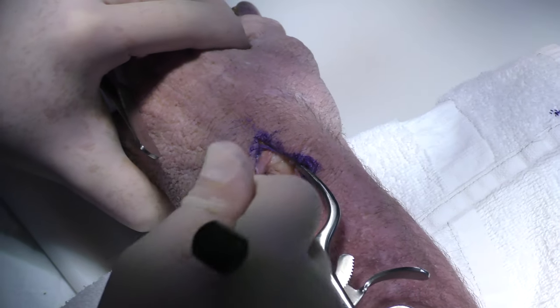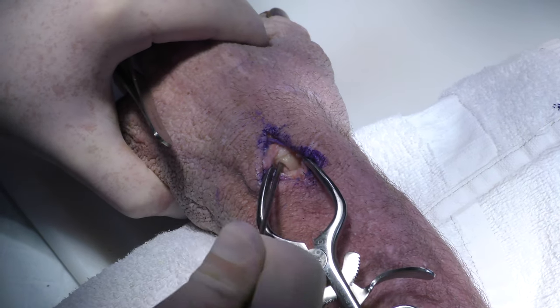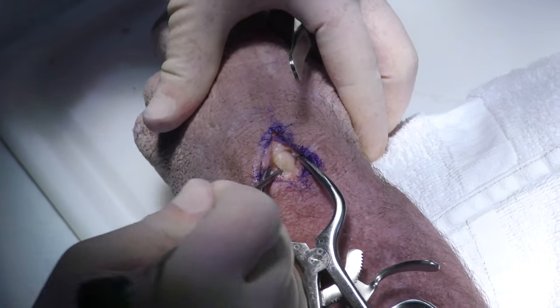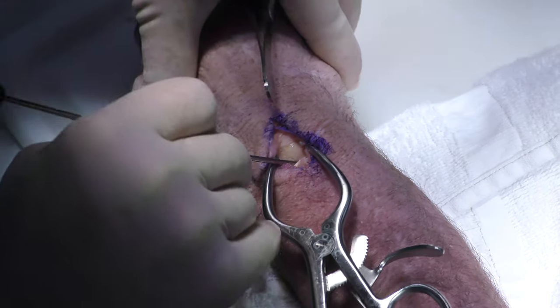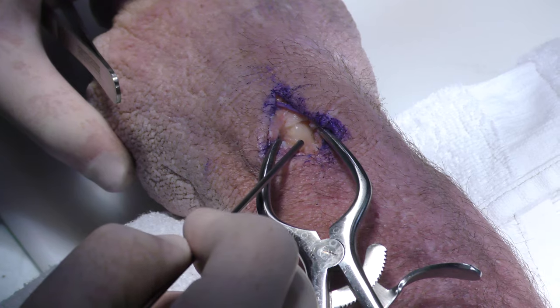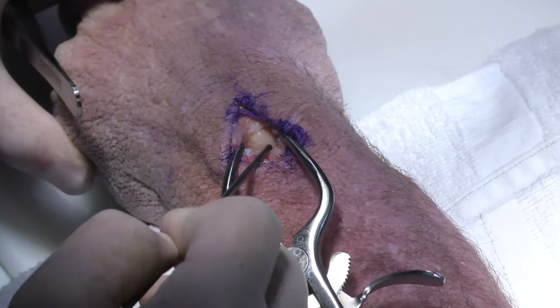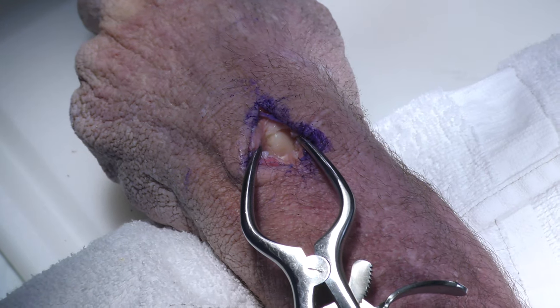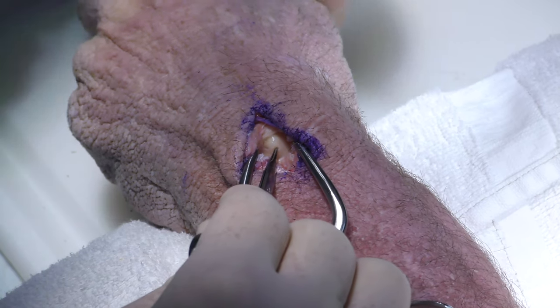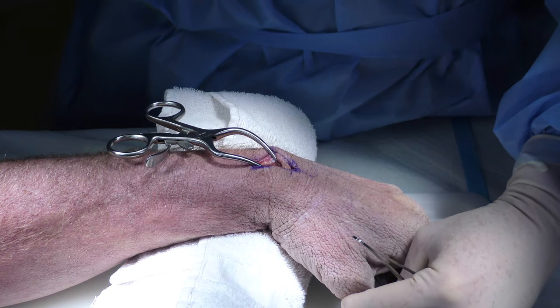Here's the ligament, this soft structure. When we flex it down, you'll see a little bit of injury in that area. But for purposes of putting this screw in, this is the ligament area, and so we want to go in the scaphoid right next to the ligament. And your target, the way you aim it, is right down the axis of the thumb metacarpal, right like that.